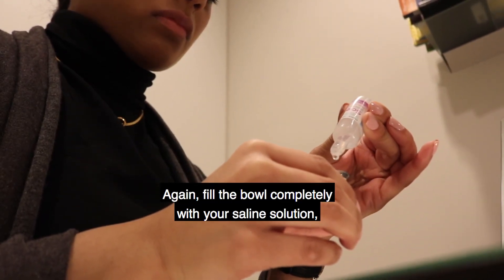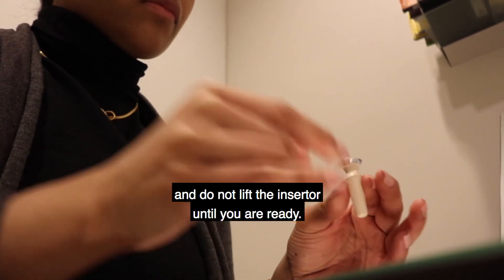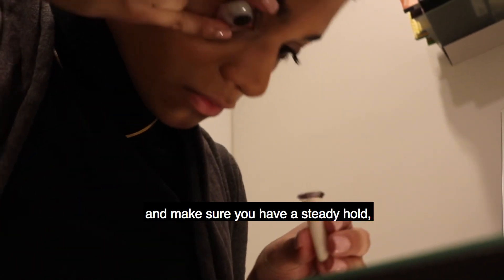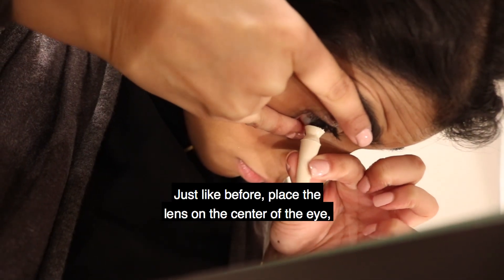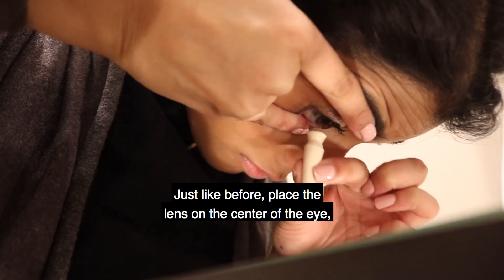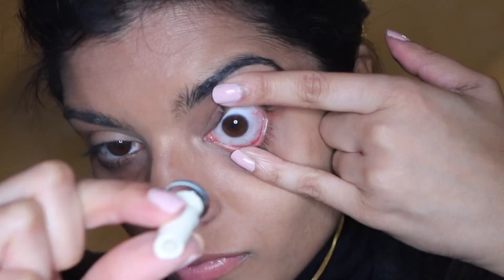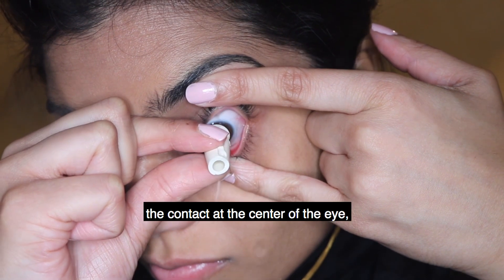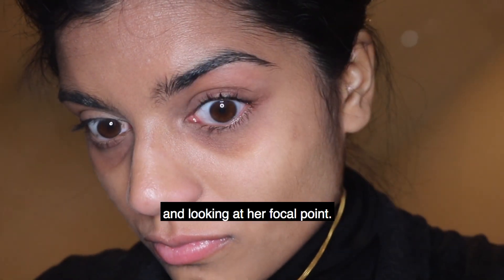Fill the bowl completely with your saline solution and do not lift the inserter until you are ready. Grip your eyelid first and make sure you have a steady hold, then bring your head down to the inserter while looking at your focal point. Place the lens on the center of the eye and give the plunger a slight push to release the contact lens. You can see that Elisa is gently placing the contact at the center of the eye while holding her eyelids open and looking at her focal point.